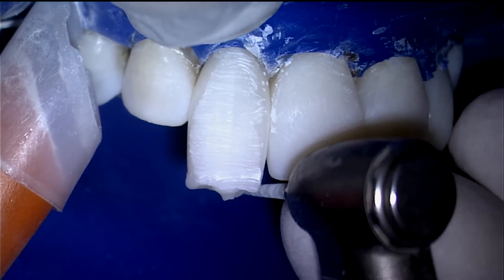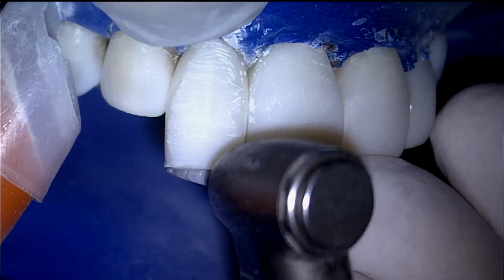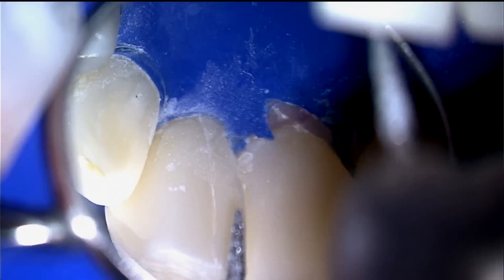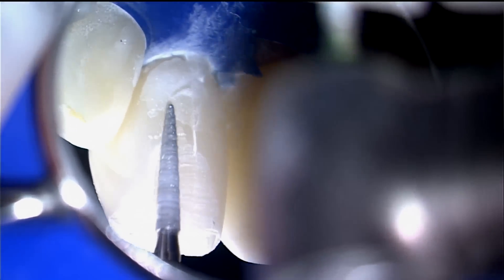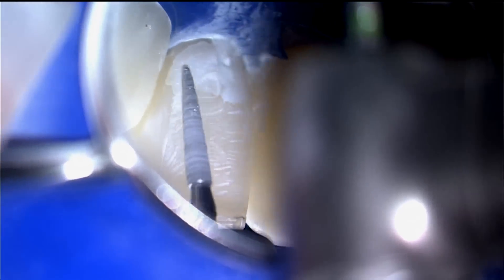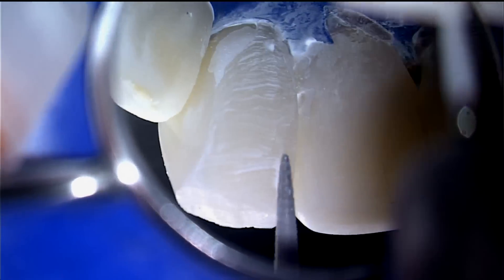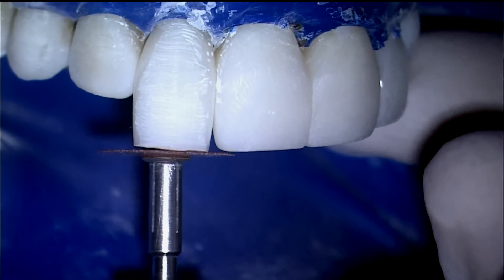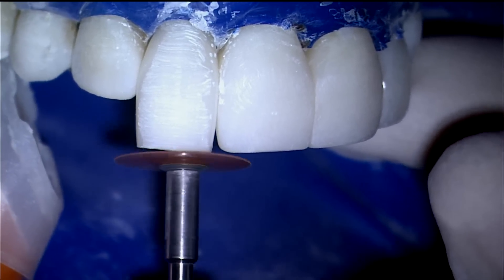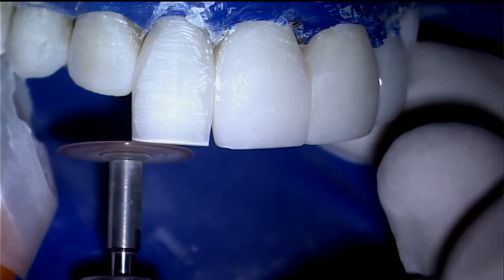Chop the excess incisal length, leaving the final millimeter to be sanded. The palatal fossa is then created. The incisal edge is brought closer to anticipated length, but final shapes are made when all of the teeth have been over molded. This is for both efficiency and symmetry reasons.